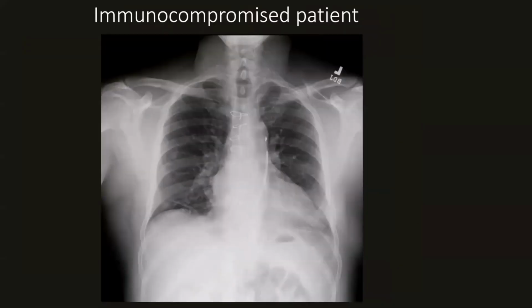This is a little bit more of a clinically interesting case. This was a patient that came into the clinic. He's a post-cardiac transplant patient, and he had a routine chest x-ray that was performed as a follow-up, and it was noted that he had this nodular opacity on a different routine chest x-ray. So he's brought back to have this DDR performed.